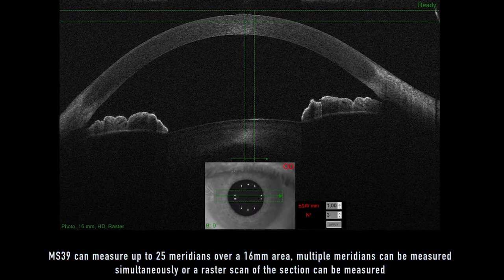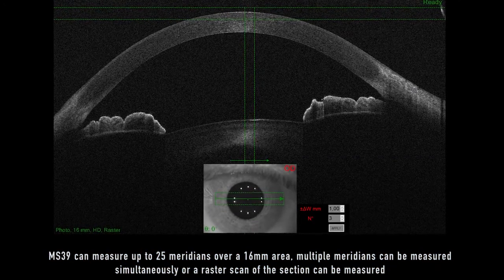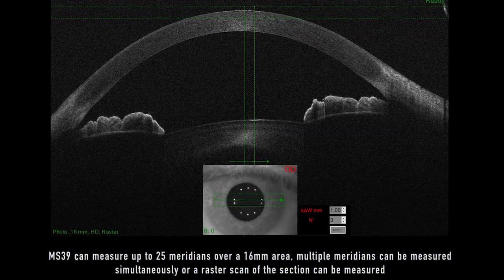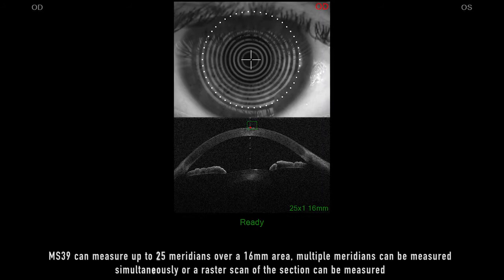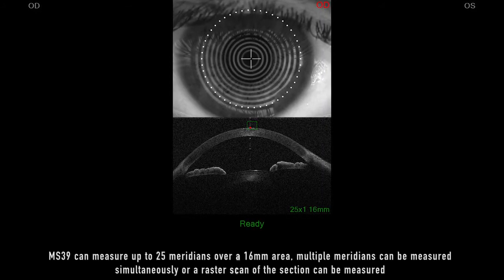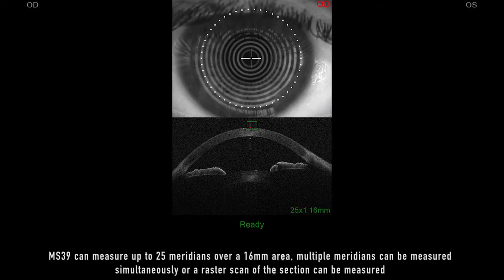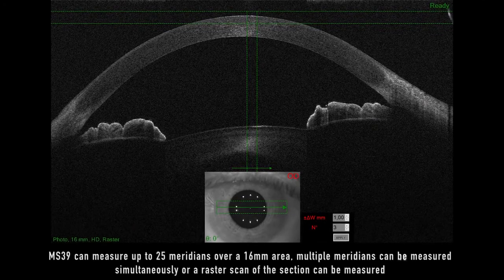MS-39 can measure up to 25 meridians over a 16mm area. Multiple meridians can be measured simultaneously, or a raster scan of the section can be measured.